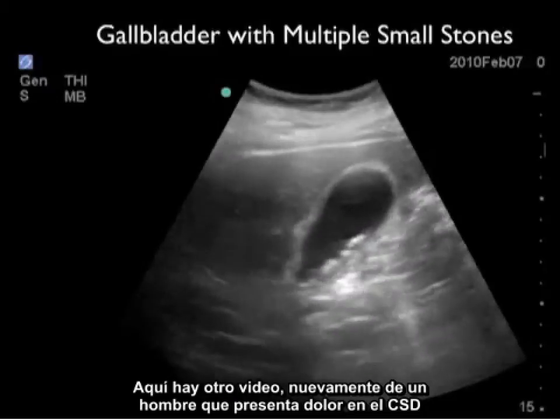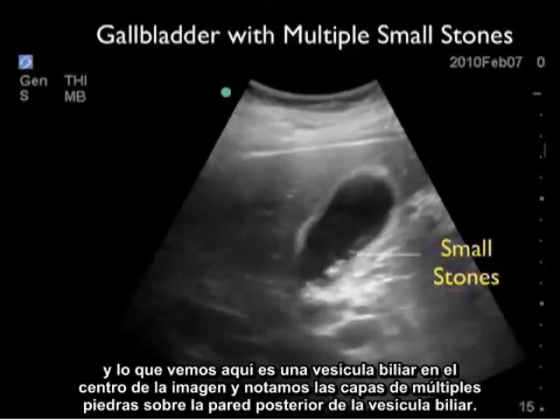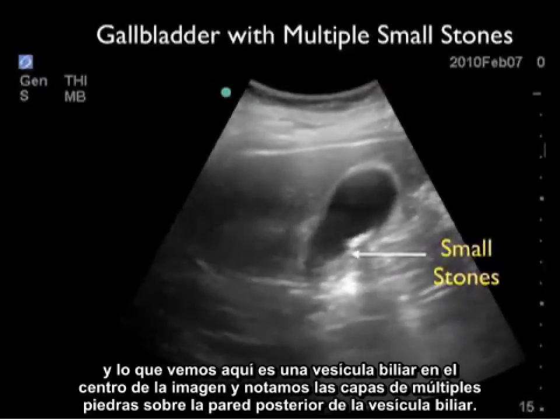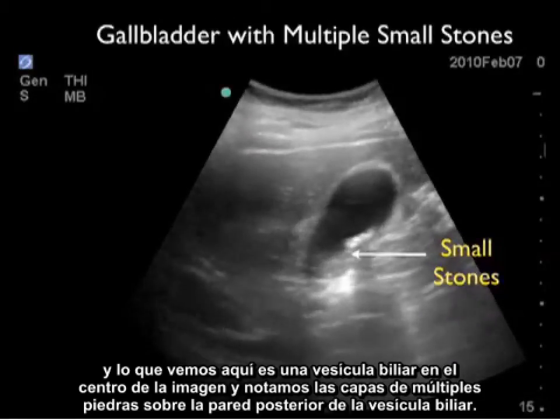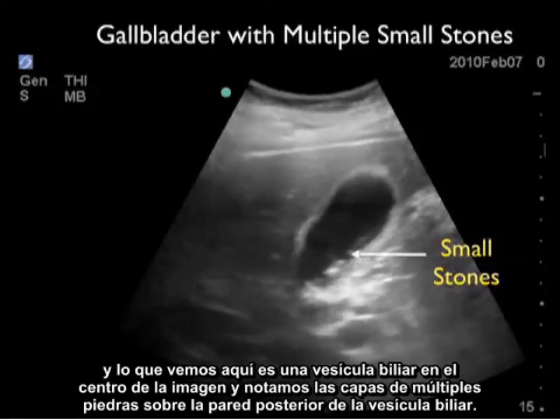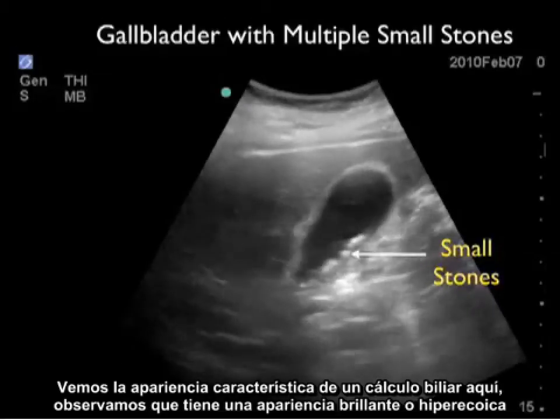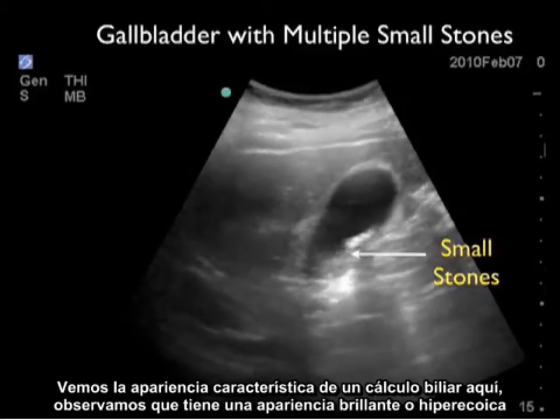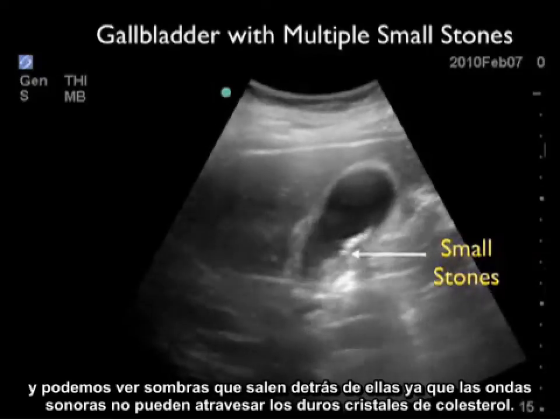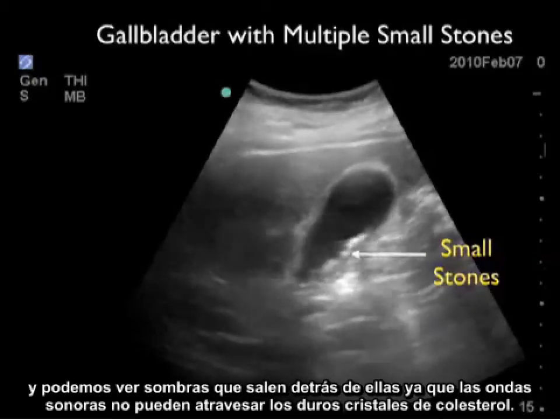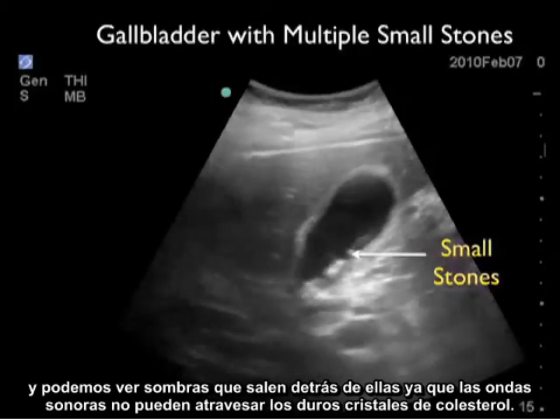Here's another video clip from a male presenting with right upper quadrant pain. We see the gallbladder in the middle of the image, and notice the layering of multiple small stones on the back wall of the gallbladder. We see the characteristic appearance of a gallstone: a hyperechoic or bright appearance, with shadows coming off the back as the sound waves can't permeate the hard cholesterol crystals.